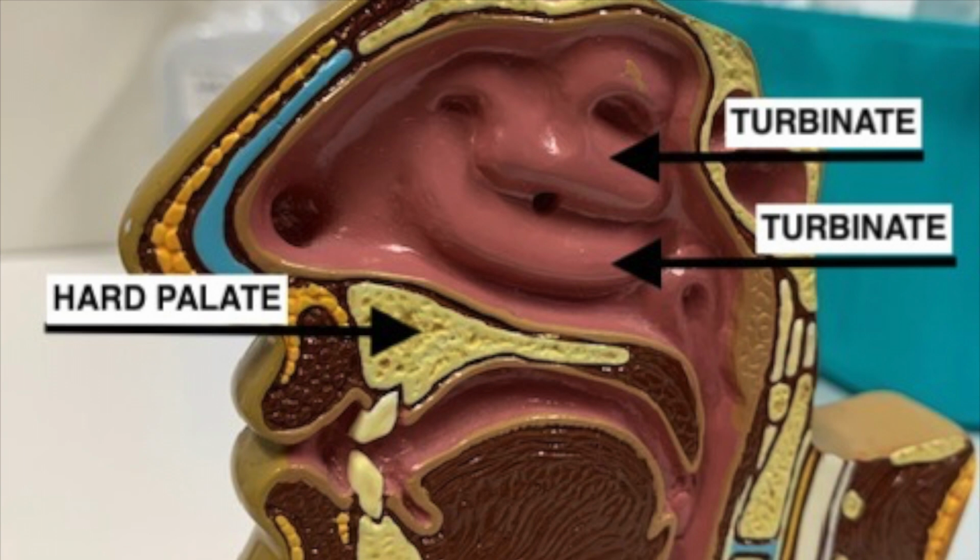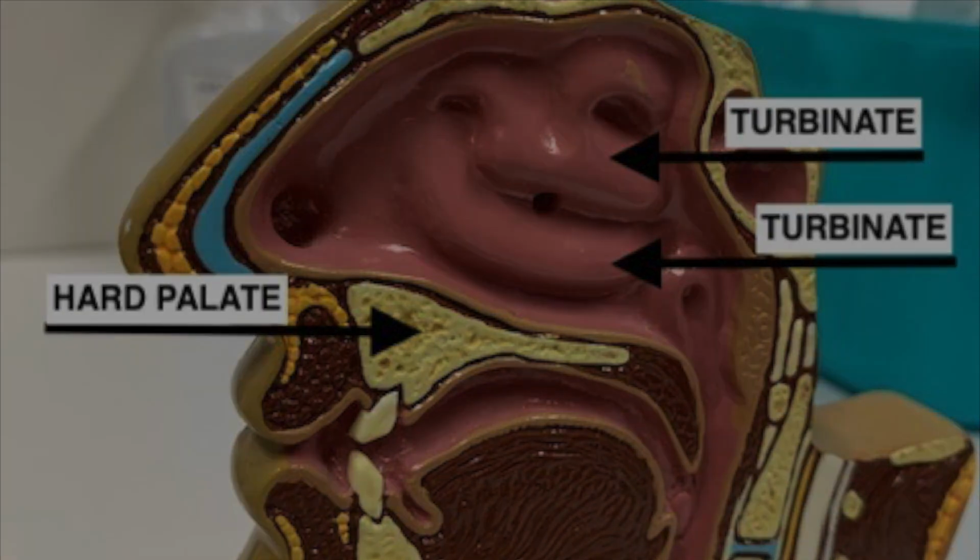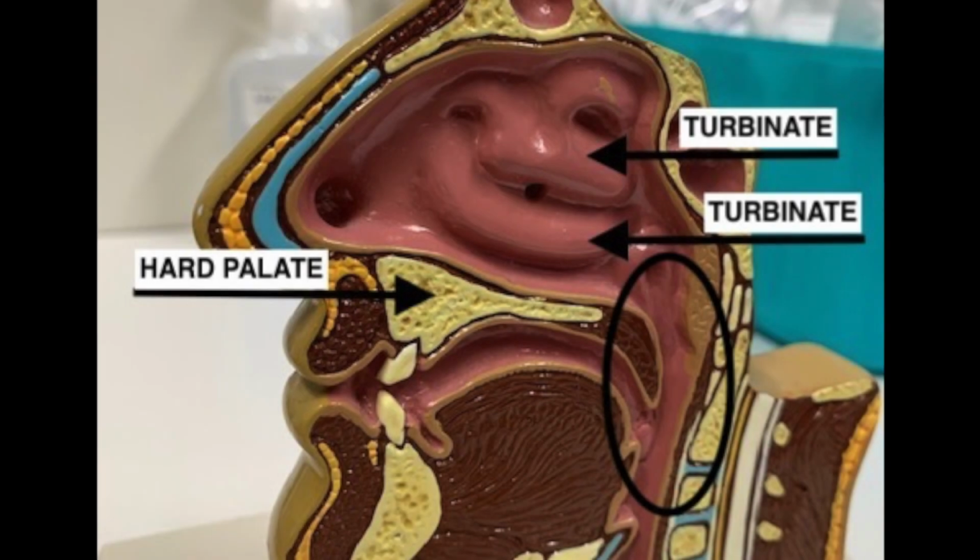Lateral walls or sides of the nose have multiple turbinates. These are bony outpouchings covered in nasal mucosa. Often, when the swab meets resistance here, it is mistaken for the nasopharynx. The swab should impact the nasopharynx, where the nasal cavity meets the throat, as circled in the diagram.